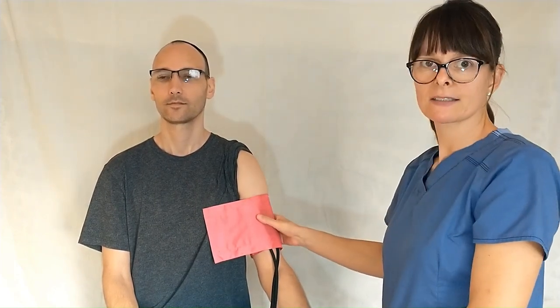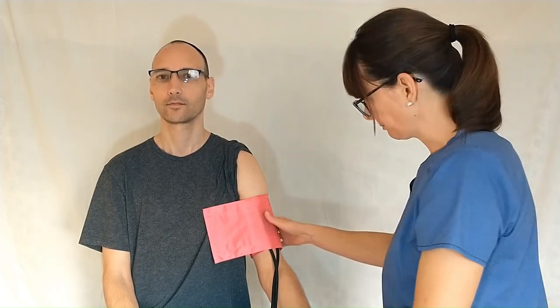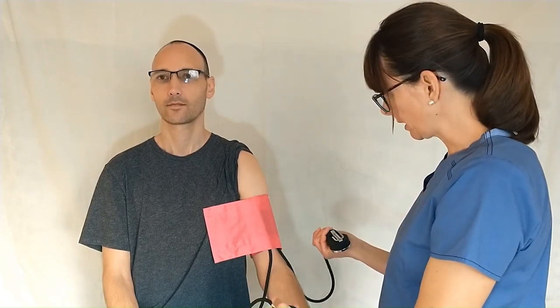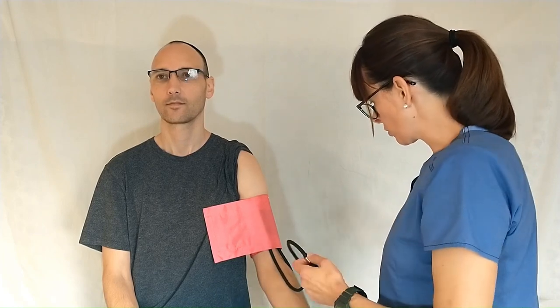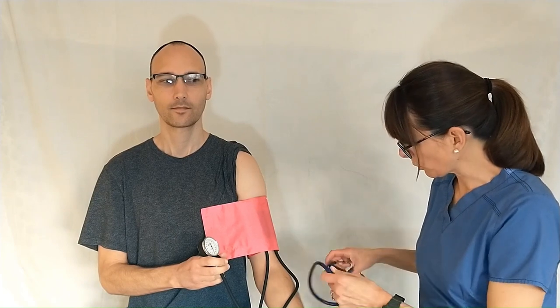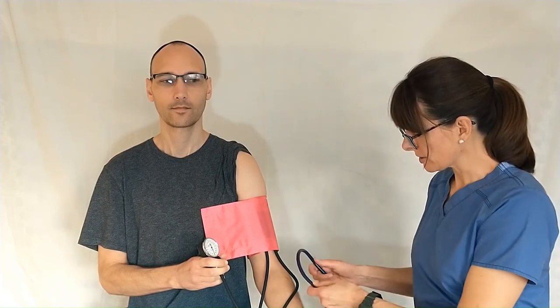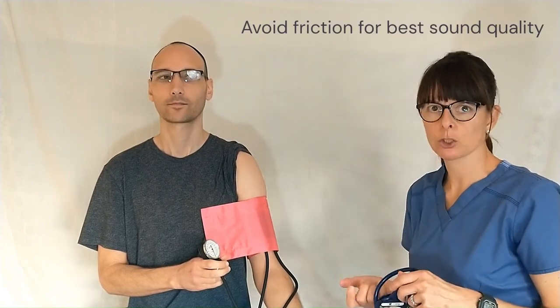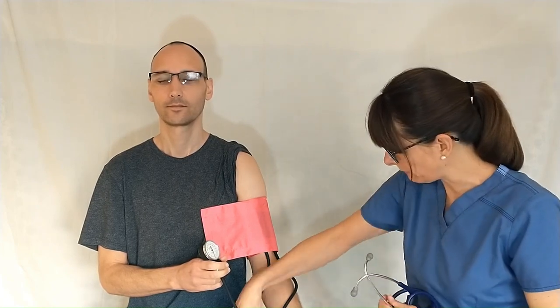You want to make sure that it's nice and snug but not too tight and not too loose — that just takes time and practice. Now we have the tubing here, which can be a little disorienting at times. I'm going to ask my patient to hold this for me. Because I'll be using my stethoscope there are going to be three tubings here. If the stethoscope tubing rubs against one of the other two, I'll have a difficult time hearing the blood pressure reading, so I always recommend detangling the tubing first.